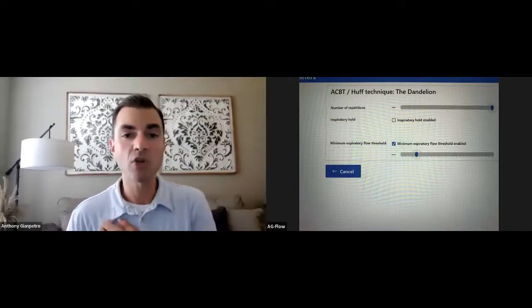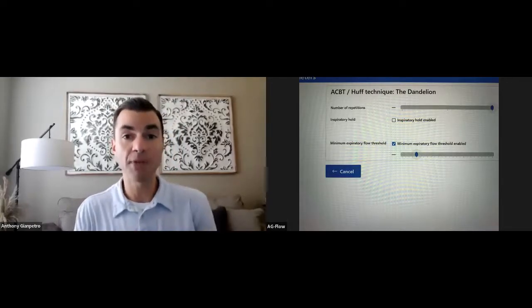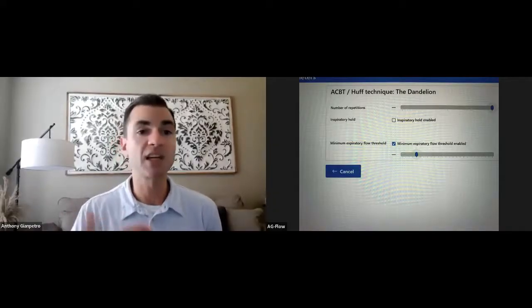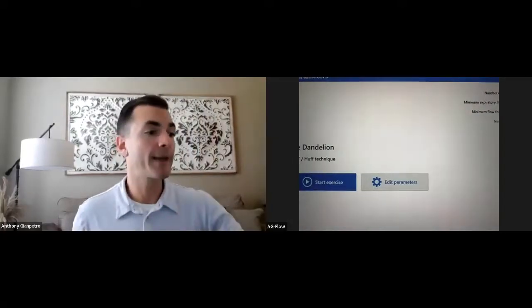And you'll see why that is. I'll try to explain that to you. But similarly with the minimum expiratory flow threshold, it can be manipulated as needed to help your patient get a more successful huff experience to clear those seeds from the dandelion. So let me show it to you, and then we'll come back.